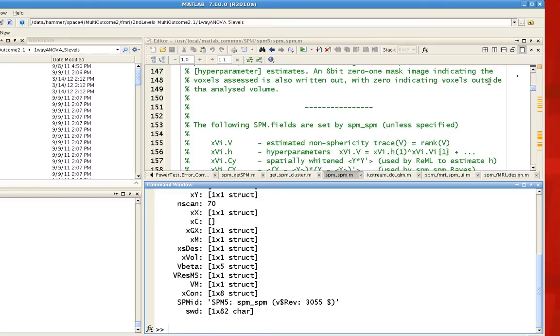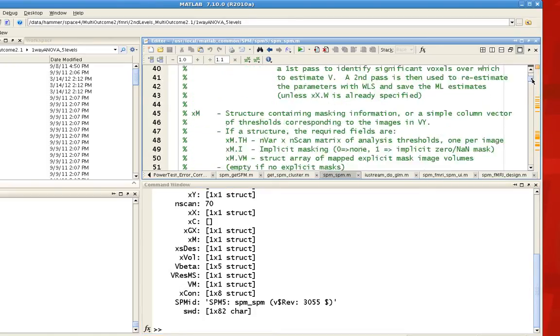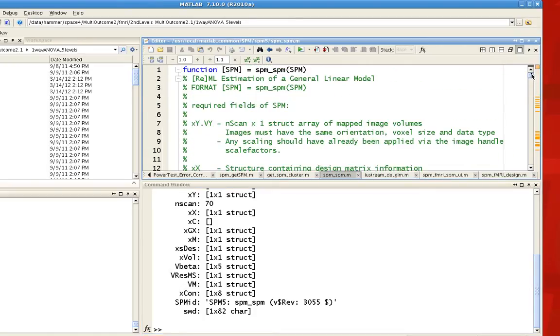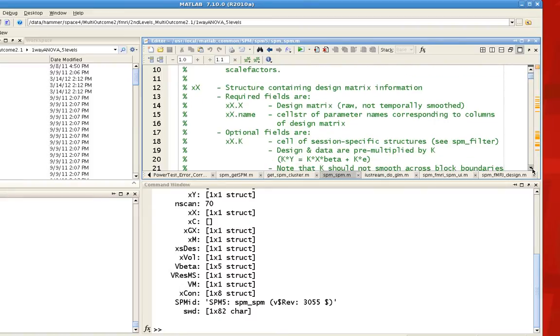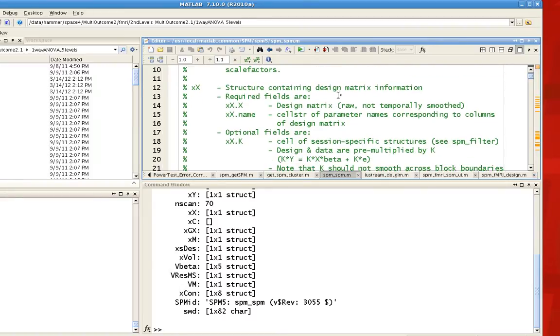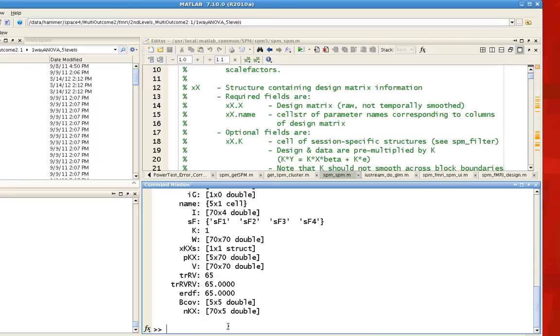So it can be a little confusing, but they have detailed information about what each of these mean inside these scripts. For example, at the top of the SPM_SPM, all of this commented information contains information about what each of these fields mean. So X, capital X, if we scroll down, that's a structure with design matrix information. If I look within SPM.XX, you can see that there is all this information here, and there's additional details in each of these substructures.